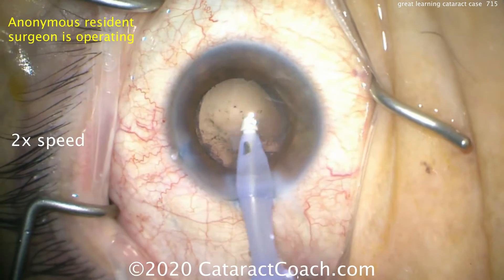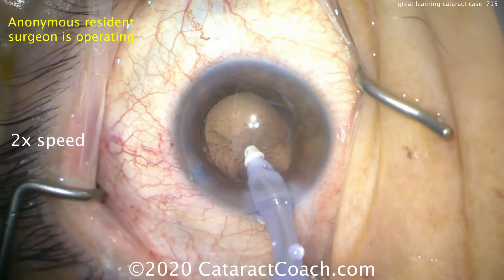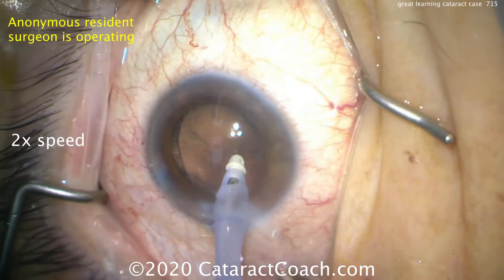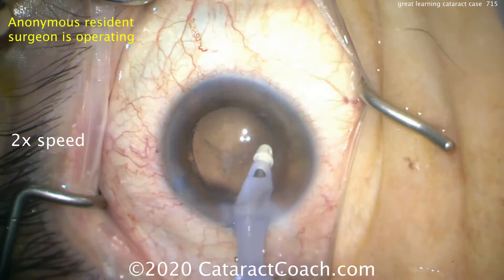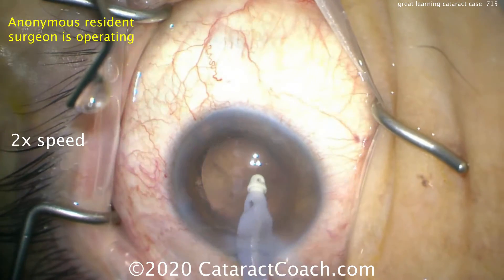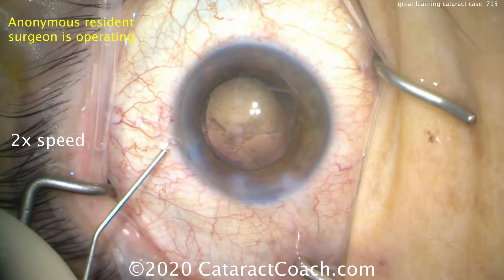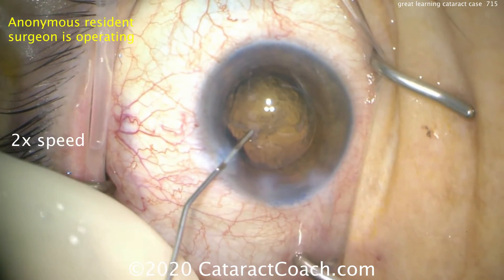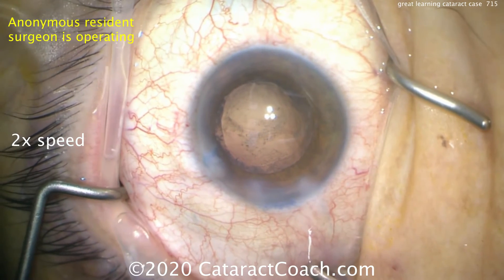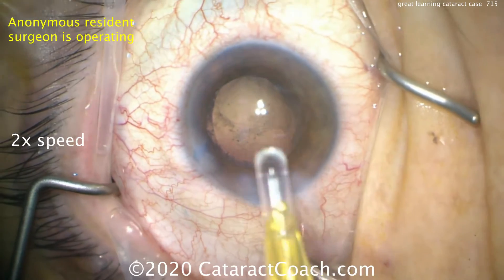Good cleanup with a little bit of wispy cortex left. Now, what about capsular bag polishing — is that something important to do? This is an interesting case. If you look carefully at the posterior surface of the posterior capsule, this patient also had a vitreous hemorrhage, and there's some blood staining there. No matter how hard the resident tries to scrub the anterior surface of the posterior capsule, you won't be able to get that out, and that's okay. This patient can always have a YAG capsulotomy in the post-op period. This patient also has a history of proliferative diabetic retinopathy and vitreous hemorrhage. Filling the capsule bag through the side port with cohesive viscoelastic — that's because it's less likely to cause release of viscoelastic through the incision. If you fill through the main incision and distort it, the cohesive viscoelastic will all come right out.